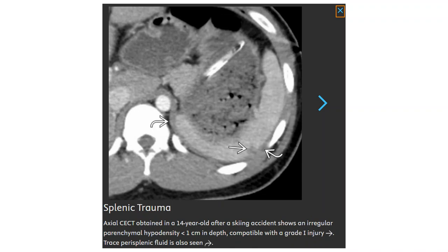Contrast CT obtained in a 14-year-old after a skiing accident shows an irregular or linear laceration less than 1 cm in depth, compatible with a grade 1 injury. A small perisplenic fluid collection is also seen.